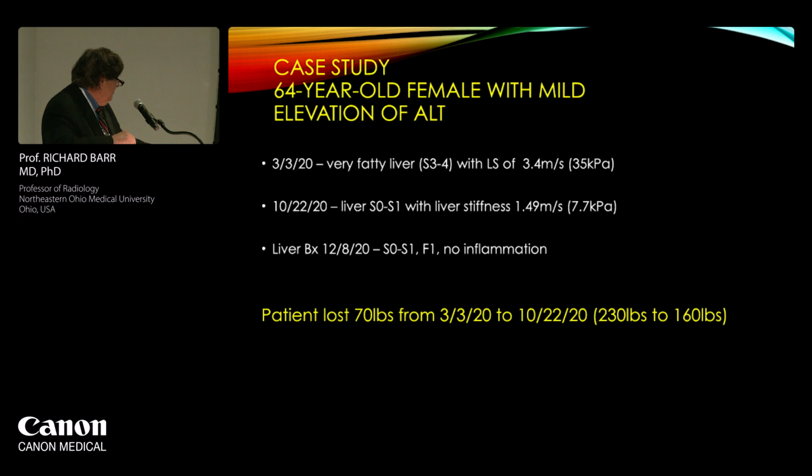So what happened? We did a biopsy, and it confirms that our results are right. She lost 70 pounds in 7 months, and just losing that weight completely resolved her fatty liver disease and brought everything down. So my idea is that maybe we don't need a biopsy to diagnose NASH. In 7 months, the fibrosis didn't change, right? This dramatic change in the kPa has to be resolution of inflammation. So maybe this patient did have NASH, and now with her modification of habits, she's corrected that.